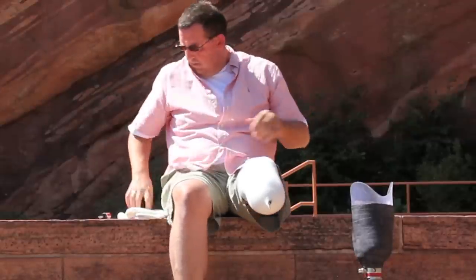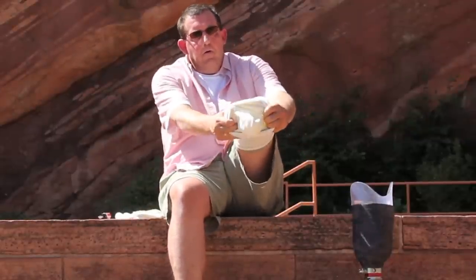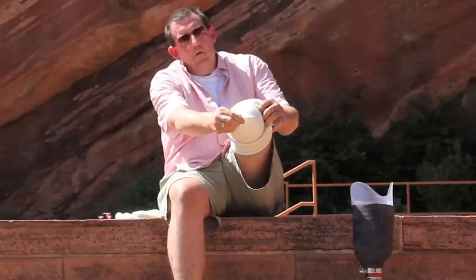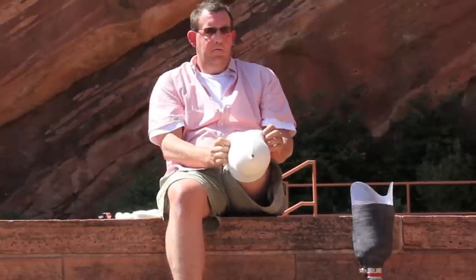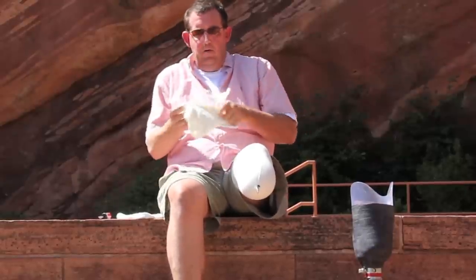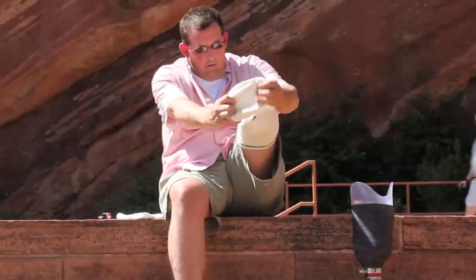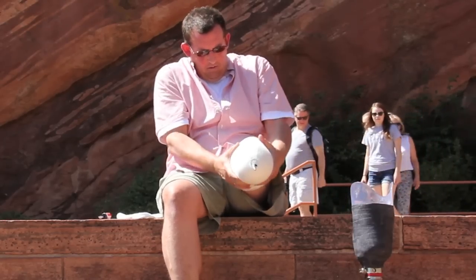Many people that use a prosthesis wear prosthetic socks over their residual limb. These prosthetic socks come in a variety of thicknesses and materials. There are many benefits and uses for these socks. They provide cushion, reduce and absorb friction, protect the skin, absorb perspiration, and compensate for shrinkage and or swelling of the residual limb.